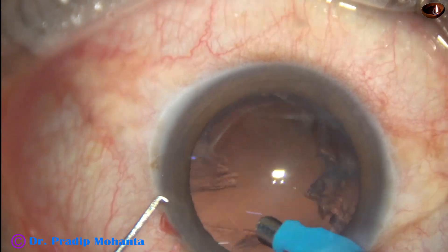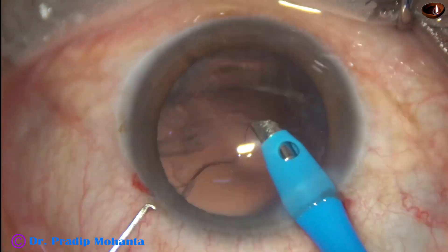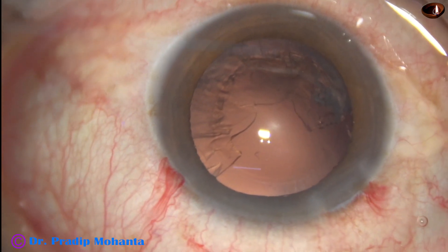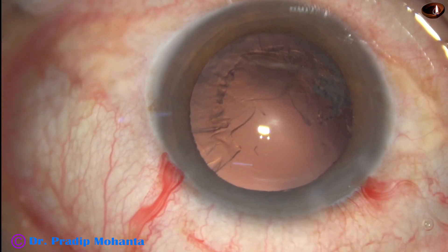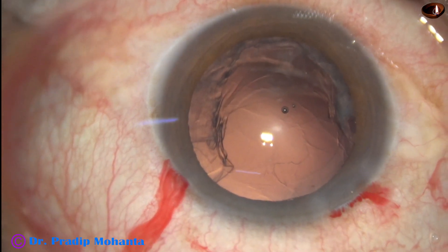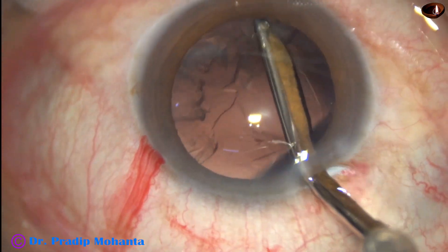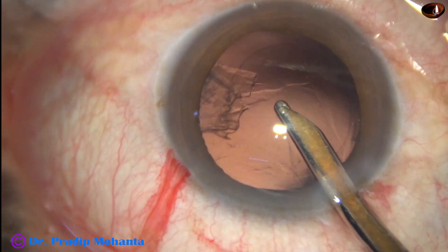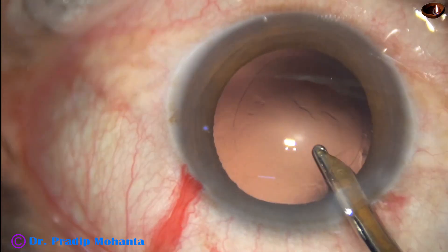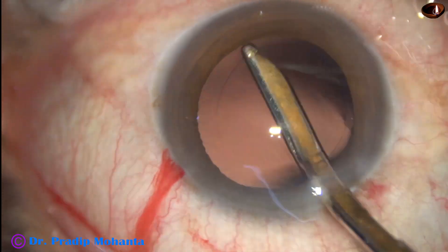Now I am using the PHACO handpiece itself to remove the sub-incisional cortex. Now I inject viscoelastic to protect the endothelium and use a SIMCO cannula 23 gauge to remove the rest of the cortex. Once the anterior chamber is filled up with visco, we get a lot of time to remove the cortex — the anterior chamber does not collapse.